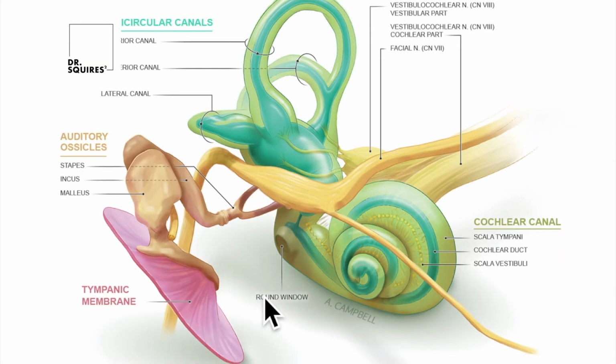All right, here we are back at the overall view of the inner ear, the balance system, the little bones in the middle ear and the eardrum. So the probe that we're using to measure sits right in here, right in the ear canal. The measurements are coming from these little neural fibers, those little outer hair cells that are located in that blue duct or the blue membrane that's represented here. That little ripple, that little response will travel back out of the cochlea, will vibrate the little bones, vibrate the tympanic membrane or the eardrum, and then is picked up at the level of our machine.